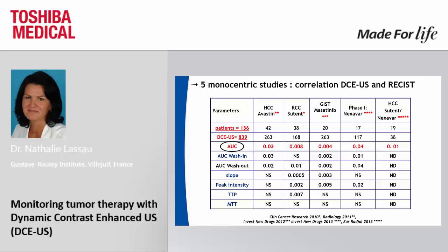We perform more than 800 DCE-US, and we understand that among the 7 parameters, only one is always linked to the response. This is the total integration during the 3 minutes. This is the area under the curve.